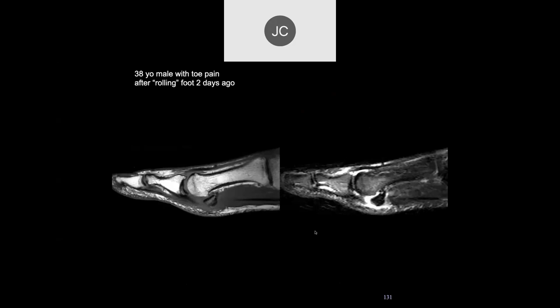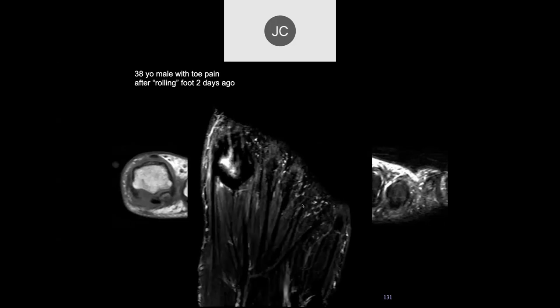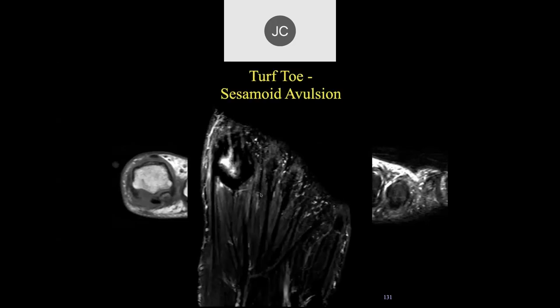There's a disruption of the proximal aspect of the sesamoid phalangeal ligament — a complete rupture with proximal retraction of the sesamoid bone. On coronal images, we can see the flexor hallucis longus, lateral sesamoid, and medial sesamoid. There's a tear of the intersesamoid ligament as well as a tear of the sesamoid phalangeal ligament. This was another turf toe sesamoid avulsion.